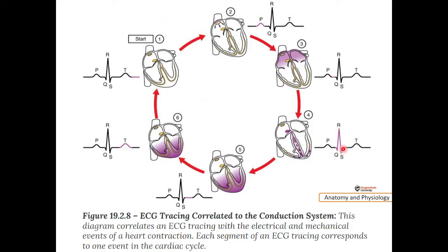This is basal or end ventricular depolarization. Then repolarization will start from the same part of the ventricle. This is the T wave. Then depolarization, repolarization, then resting.